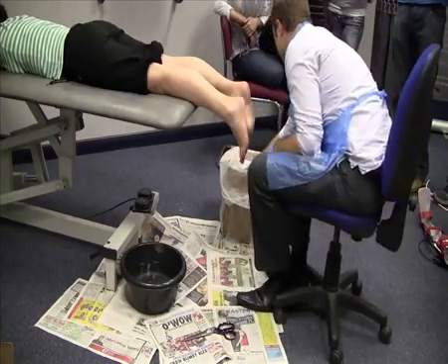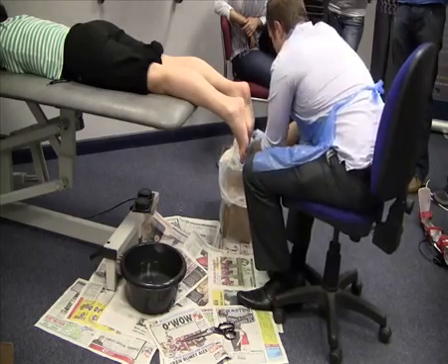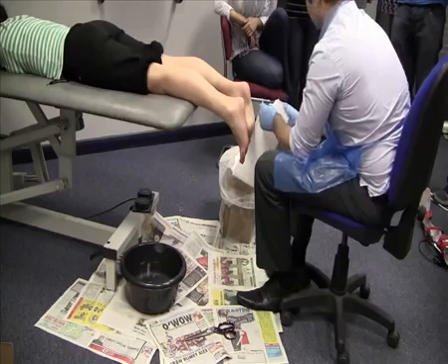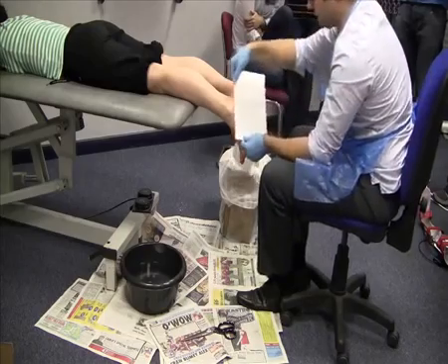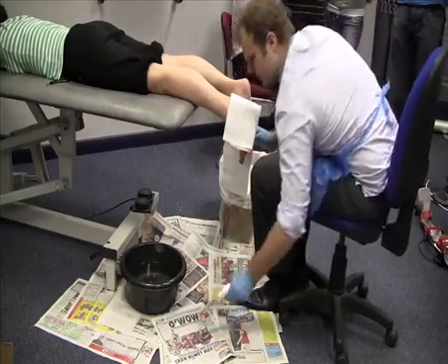Preparation. Cloud of dust. Always double up your plaster. I measure around from the 1st to the 5th. I'll do it this side. I've got the camera rolling. 1st to the 5th.